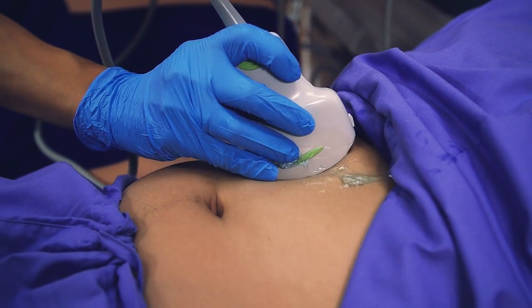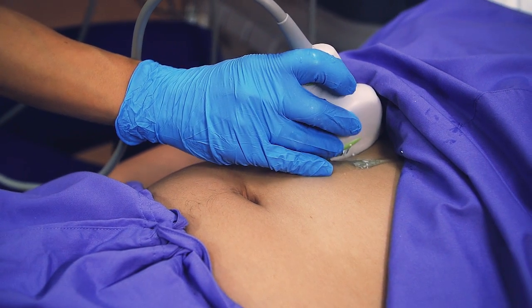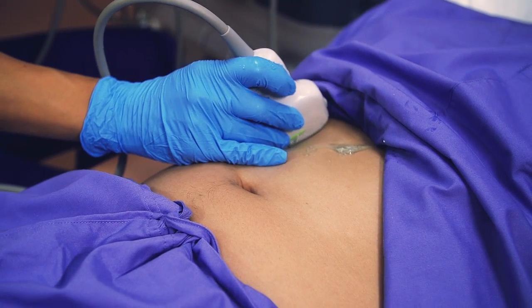The sonographer then gently passes the transducer over the skin of the area being examined, producing a sensation of light pressure.